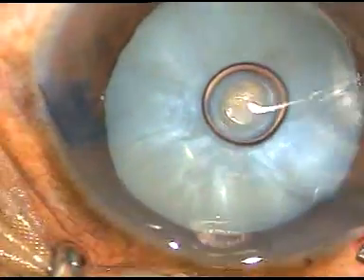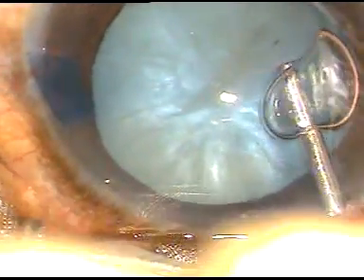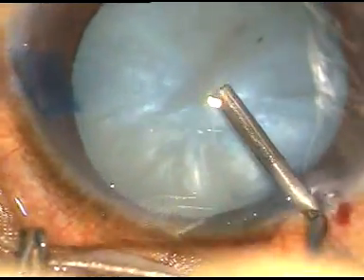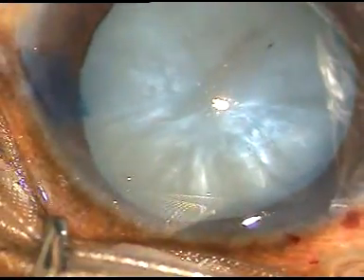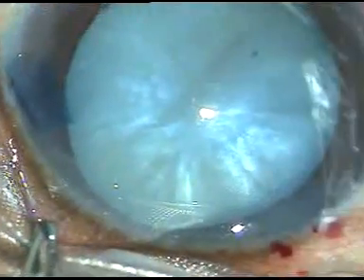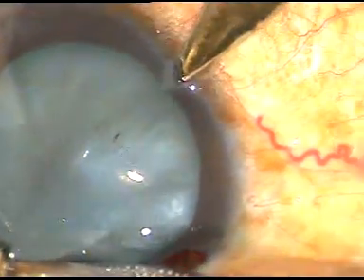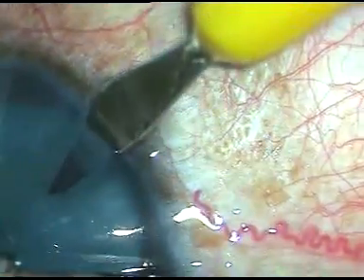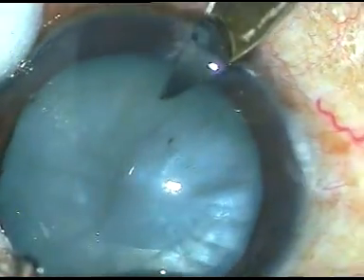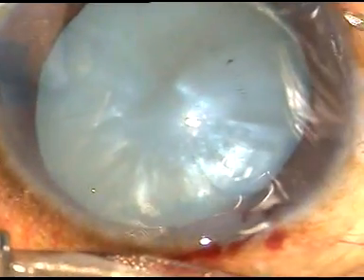In this case, the main incision and one side port incision on the left side of the main incision has been made by this time. The capsule has been stained with trypan blue dye. Viscoelastic substance 2% HPMC has been injected into the antechamber, and now another stab incision is being made on the right side of the main incision. So we have one main incision and two stab incisions.